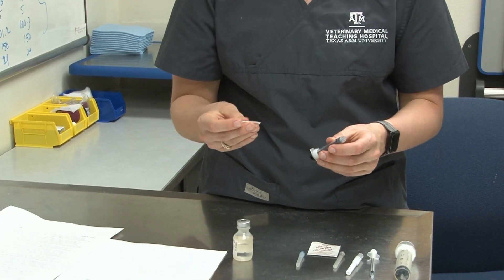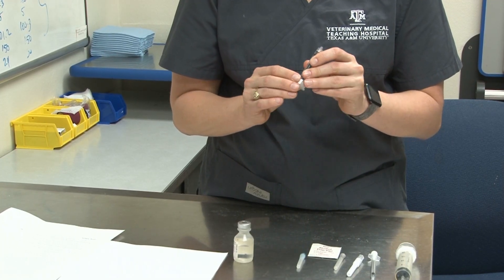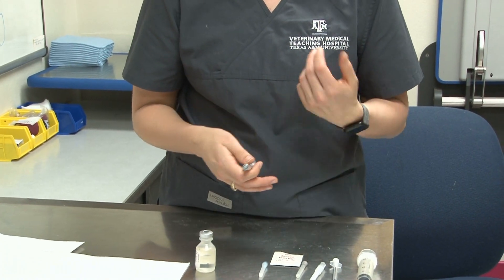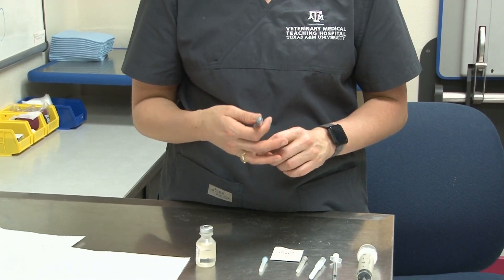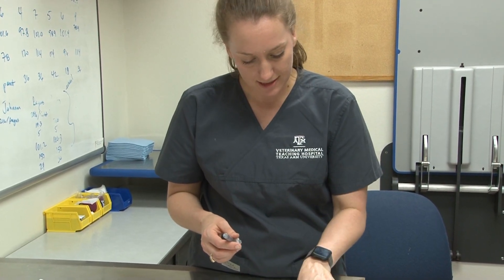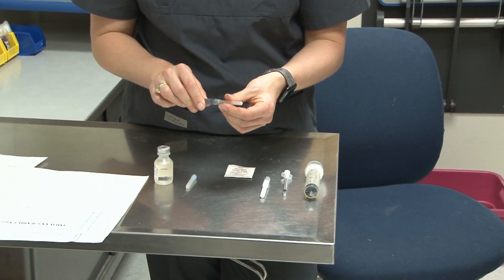We're going to label it with the drug name and the amount, and then we're going to pick our needle size. Reveille is a dog, so we're going to pick a 22 gauge needle. We have a 23 gauge which is smaller, and a 16 gauge which is going to be a little too large, so we're going to use the 22 gauge needle.